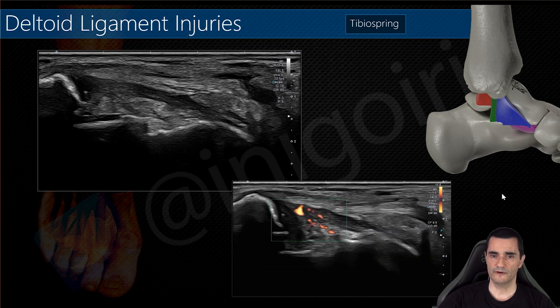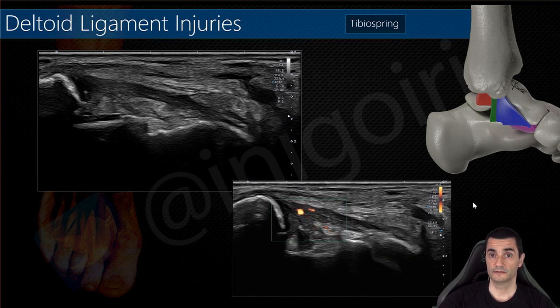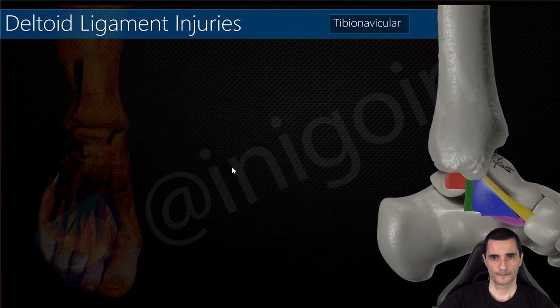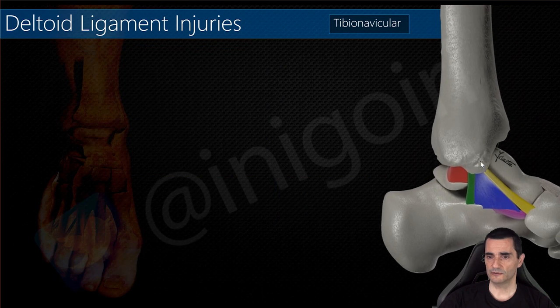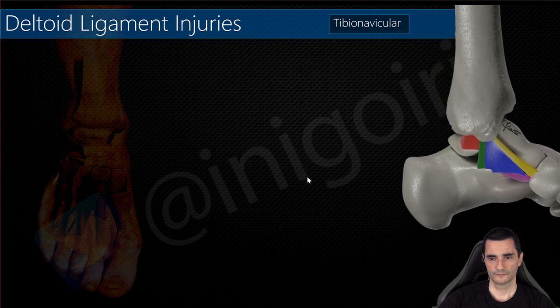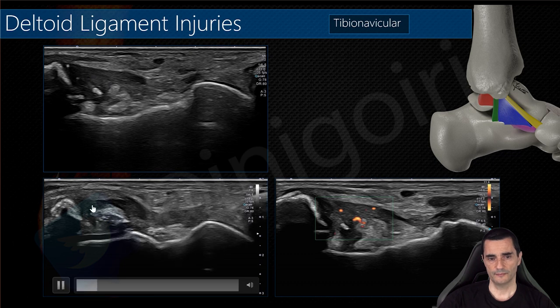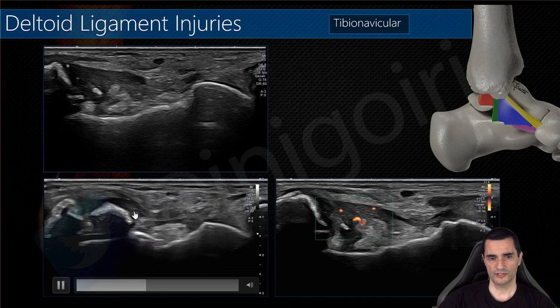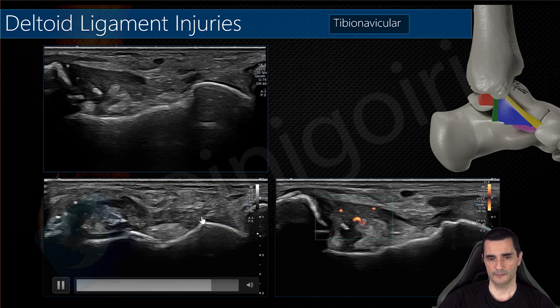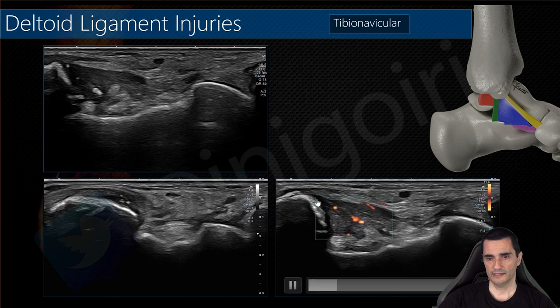We can very accurately name the components of the deltoid ligament affected. Now the tibionavicular ligament, just anterior to the tibiospring. Here the tibia, the head of the talus, and the shadow of the navicular bone. This is the end of the spring ligament. You can see the hypoechoic thickening of the tibionavicular ligament with, in this case, a large bony avulsion of more than one centimeter, edema in this tibionavicular component, and vascularization on Doppler.